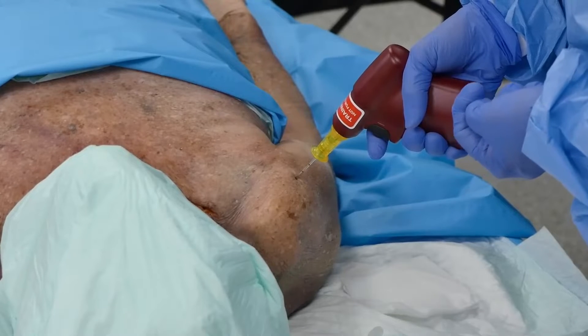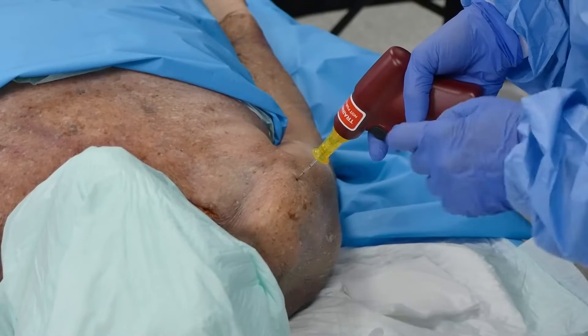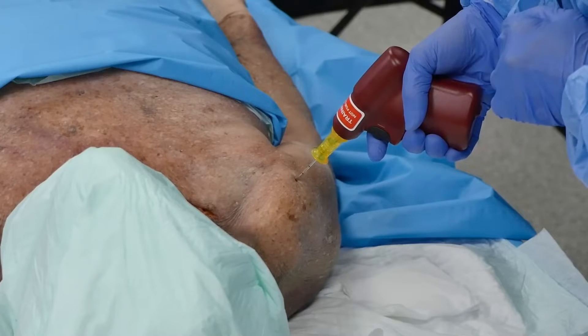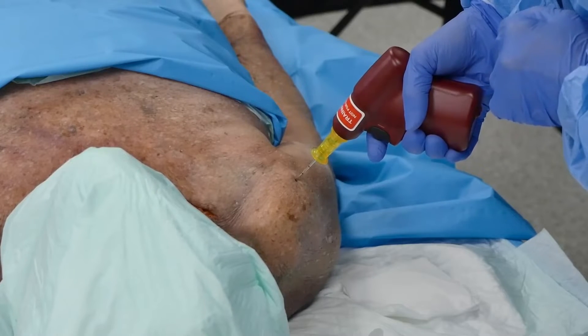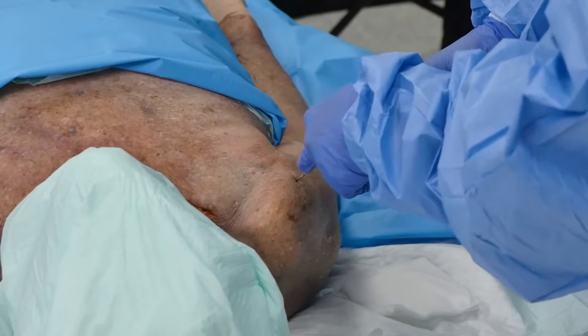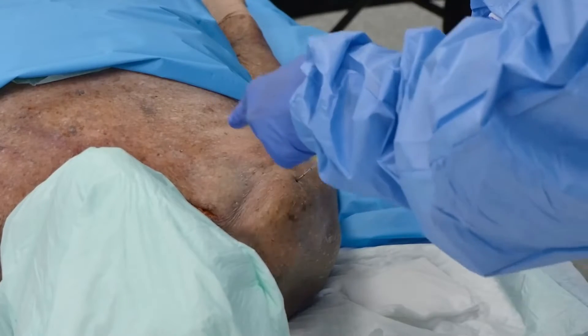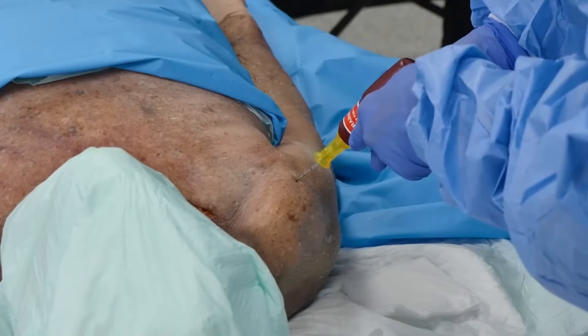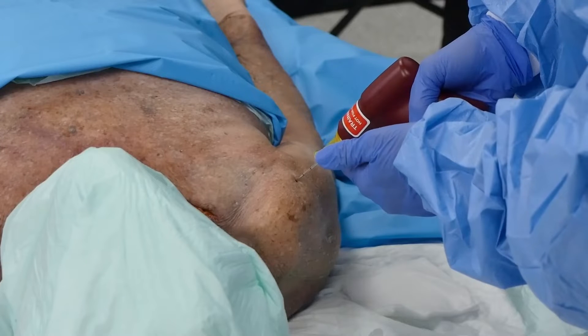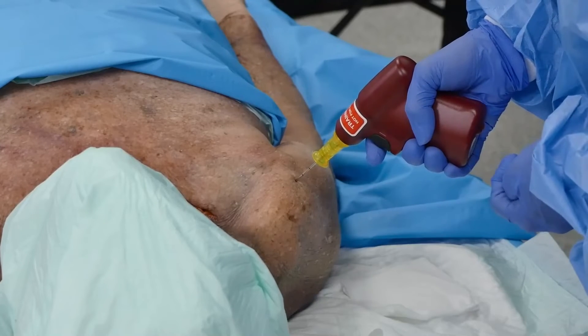You can see I've chosen the yellow 45 millimeter needle set, which is appropriate for this patient that weighs greater than 40 kilos in the proximal humerus. I'm going to provide one continuous insertion at a 45 degree angle to the bone and at a 45 degree angle as if I'm aiming towards the opposite hip, and I can insert this needle set until the hub is close to the skin.